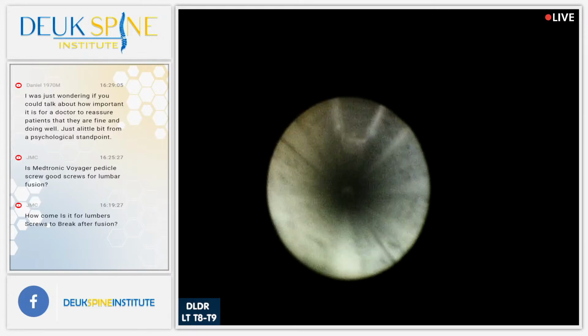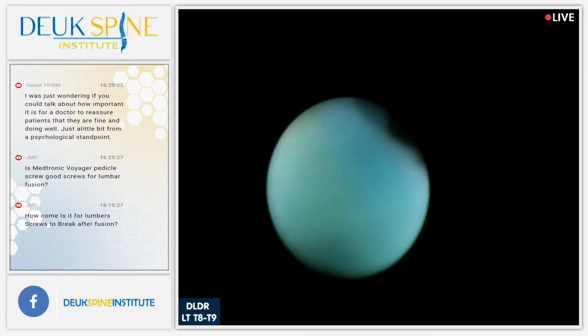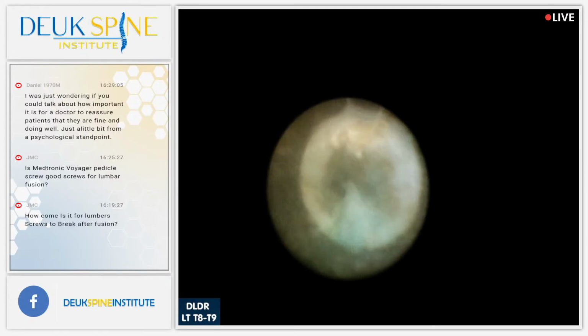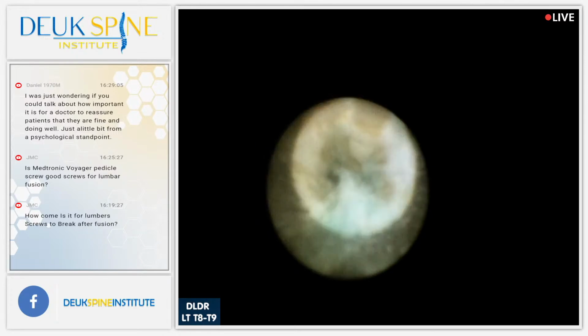That's what we do. We just did one of these this week, 2 days ago. You see the herniation right there? Yes, we do. Oh yeah, here it comes. So anyway, if the surgeon puts too short of a cage, not tall enough, then guys, why is the suction not on this bag? It's starting to pool, okay?